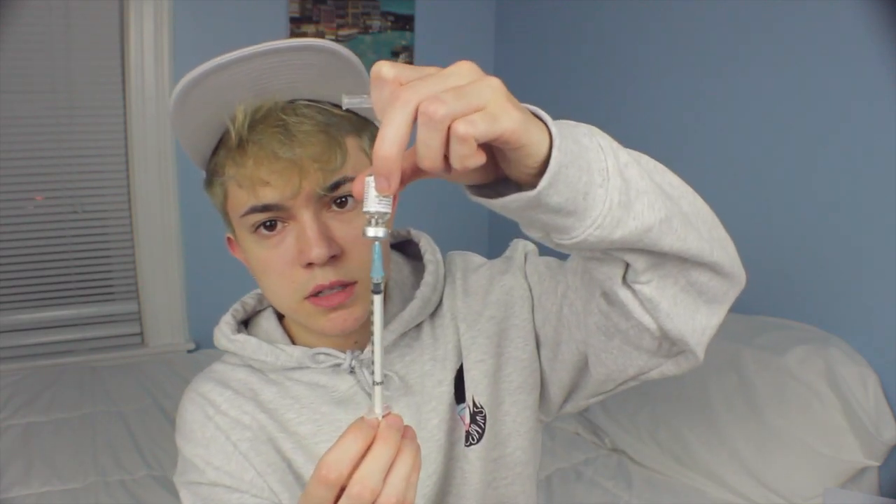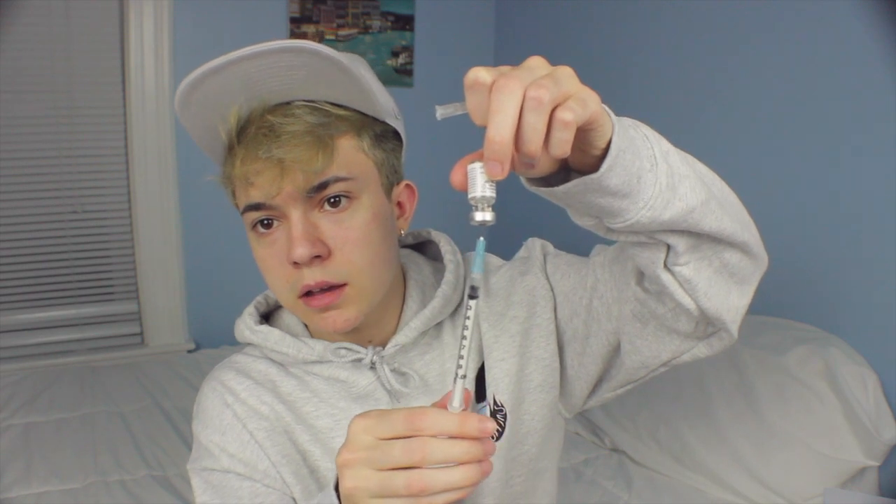I do this on a flat surface — I don't like doing it without one. Once you put this in, there wasn't enough in this bottle so I had to grab a new one. But basically you just pull back. I'm going to have to skip a lot of this because it takes forever.